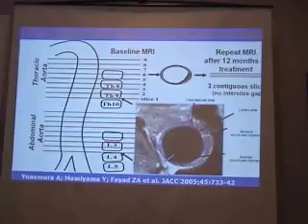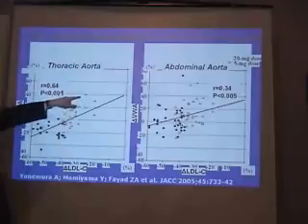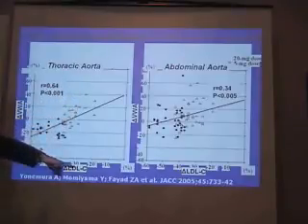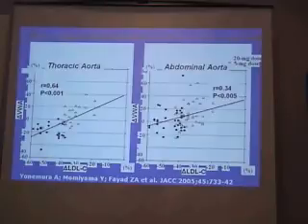And it's fascinating. It really takes into account the technology I am mentioning to you, but I'd like to show you the power of this technology. Here's a situation where you give atorvastatin 5 milligrams or atorvastatin 20 milligrams. And the greater the decrease of LDL, the more significant the decrease of atherosclerotic disease burden over a 12-month period. So you see visually exactly what goes on, and you can correlate. And I think this is beautiful.